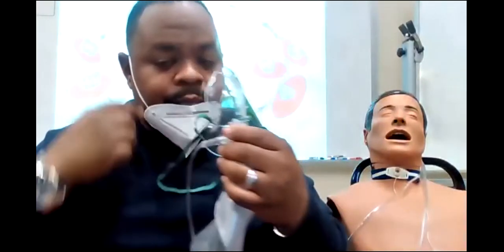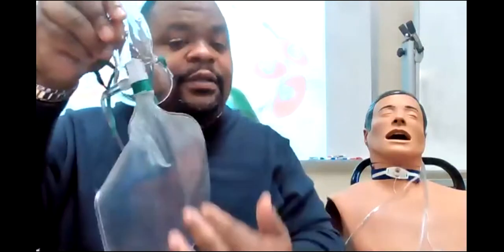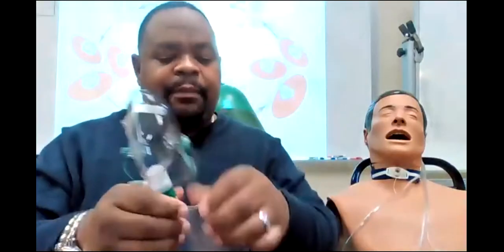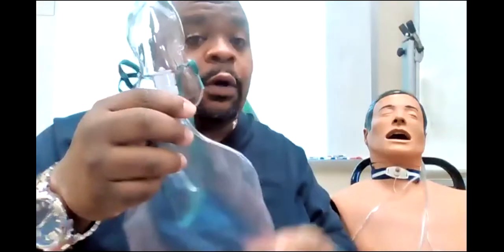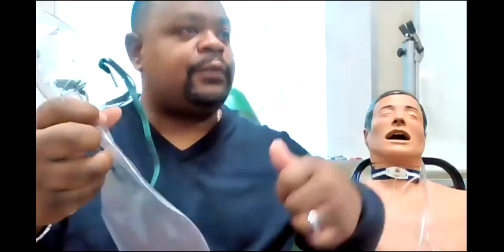When I exhale, my first third of my breath will go into the bag. And when I inhale, that first third will come right back to me. That's why it's called a partial rebreather. I'm partially rebreathing my own gas. Now, the trick about this is when I turn this on, that bag should inflate. And when a patient has the bag on his face, it should never deflate completely when they inspire. If he takes a breath in and that bag is flat like this, I need to increase the flow.